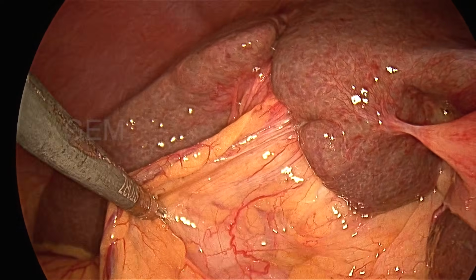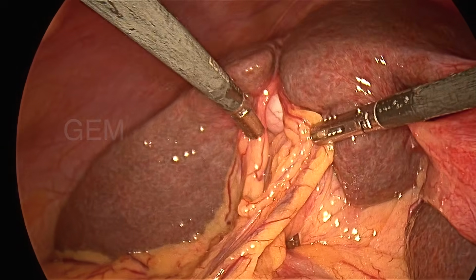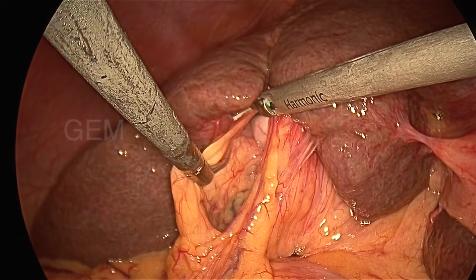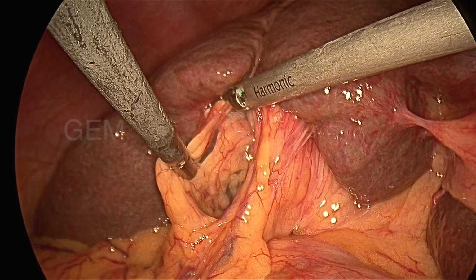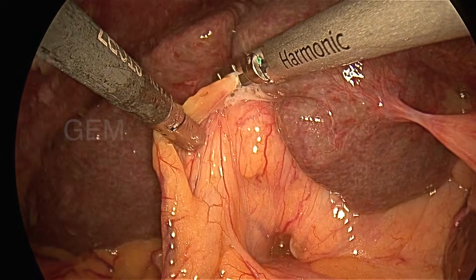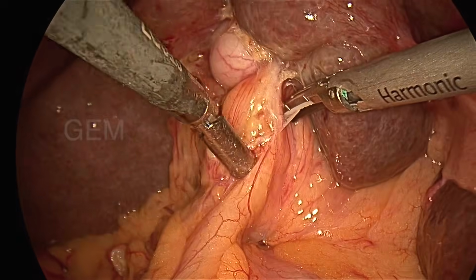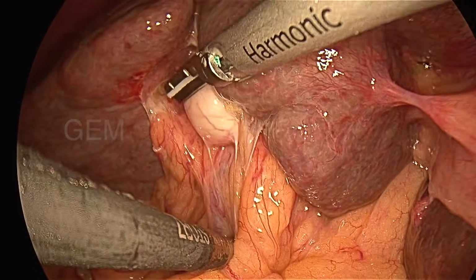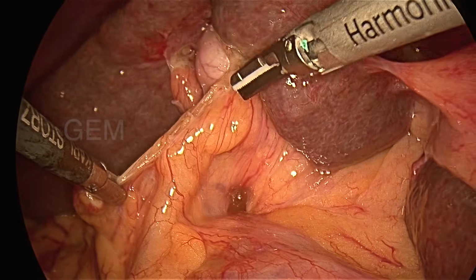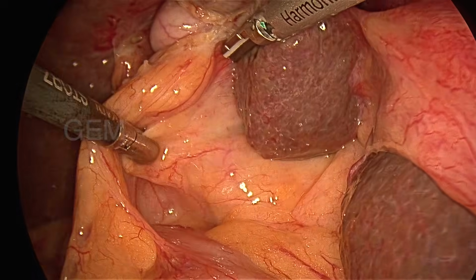So it's very much contracted. You can see that it's like a fissure, a split in the liver, and the gallbladder lies within that. Most contracted gallbladders are like this, a long-standing thing. If there is a cystic duct obstruction, the gallbladder gets distended, and if it is a chronically treated case, it becomes contracted. Each time it is treated with antibiotics, that area becomes fibrotic, so it becomes a contracted gallbladder.